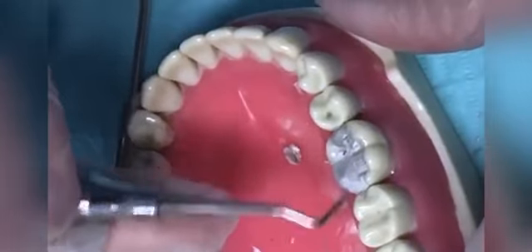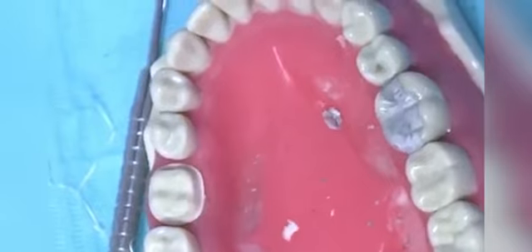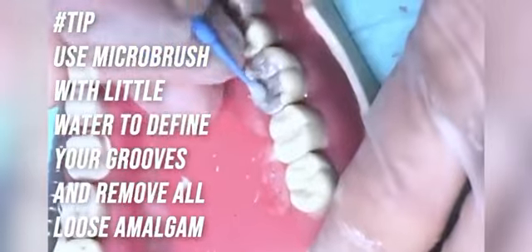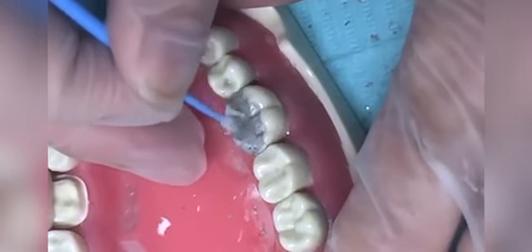And while you are doing the carving, I suggest try to use the cotton roll in between. It will give a very good shine and polish. Here in the end, I am using the applicator tip, but you can use it in between while you are doing the tooth carving also.